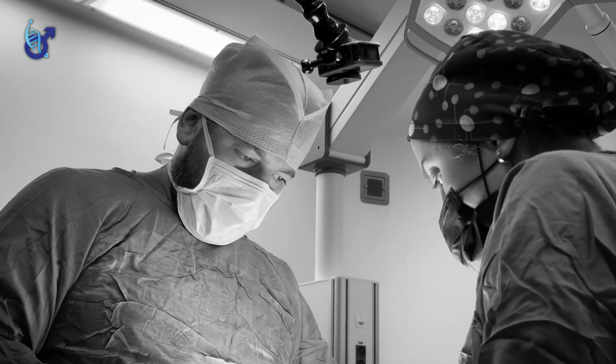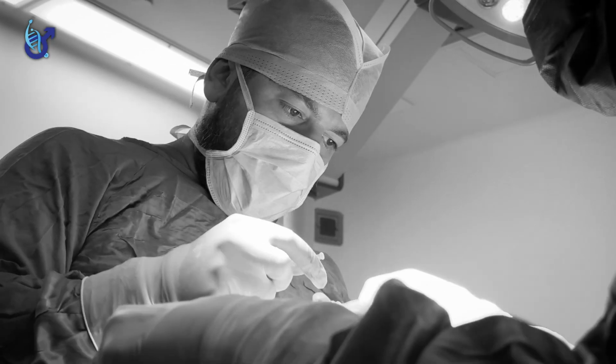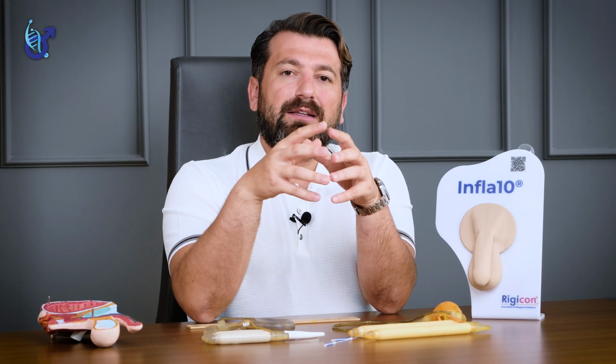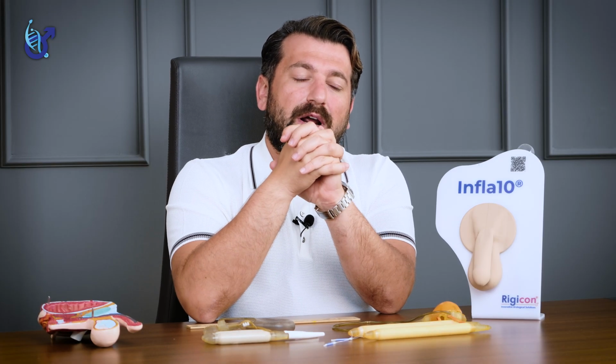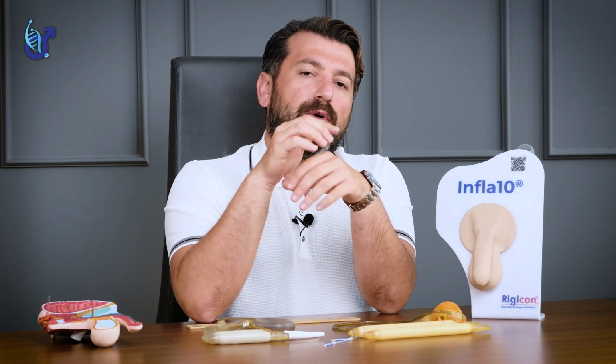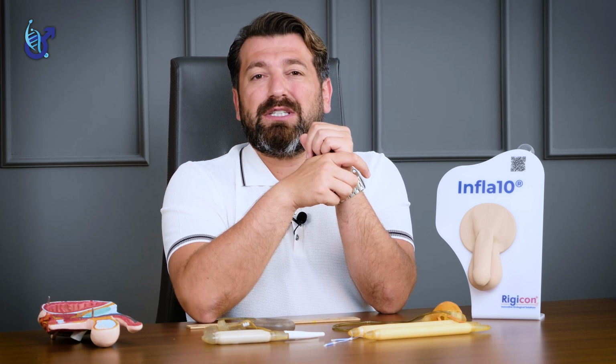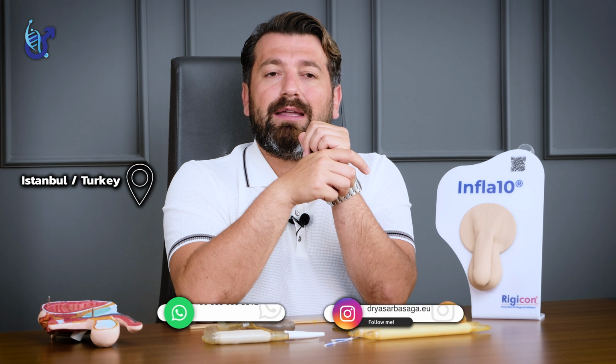We operated on this patient, took out the old implant, and put in 3 centimeters more, a 24 centimeter implant, because the implant had caused some dilatation in the corpora cavernosa. We put in the 24 centimeter implant with a more proximal infrapubic approach, and after 6 weeks of surgery the patient went into sexual intercourse. Now he told us, yes, I can penetrate the vagina. I have the axial rigidity and I have gained my length back and I am very happy with my implant surgery.